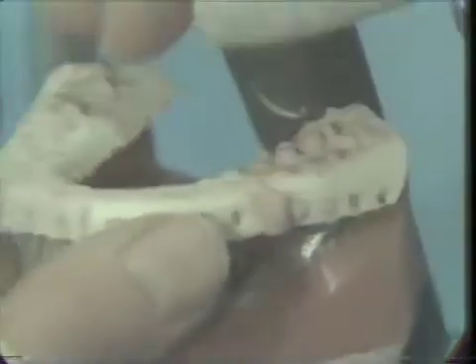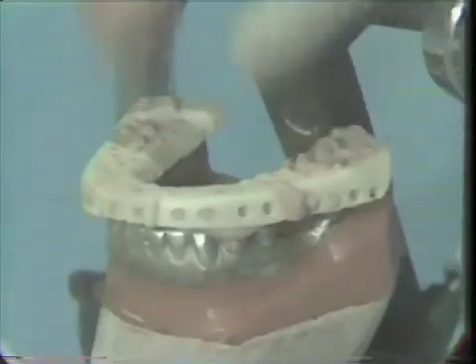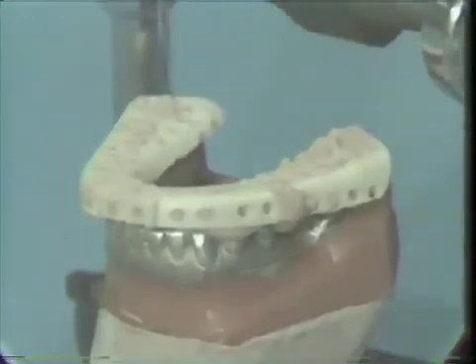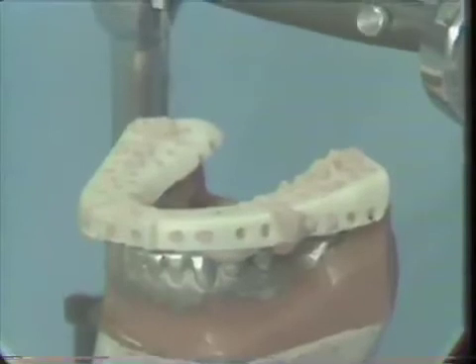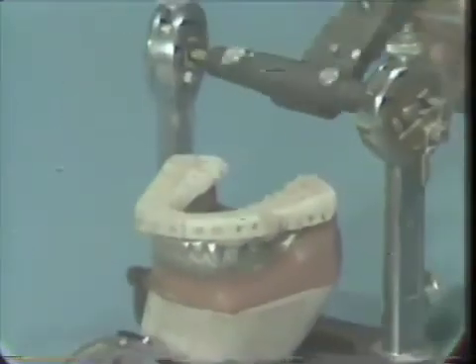So now all that's necessary is to reposition the stone key onto the articulator, and here you can see it's quite stable, and attach it to the upper portion of the articulator, and this will give us our functionally generated key.